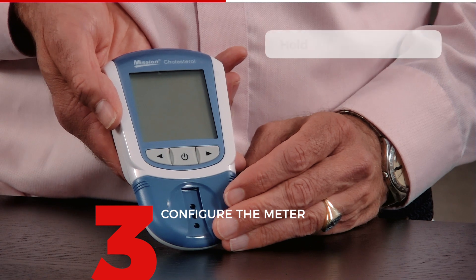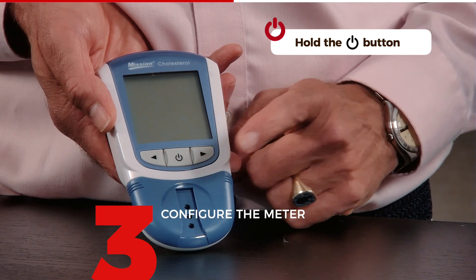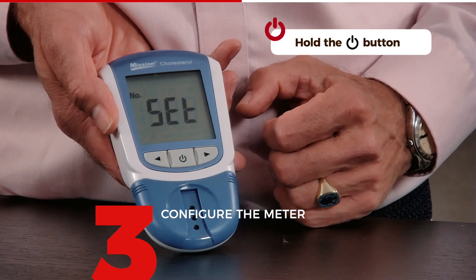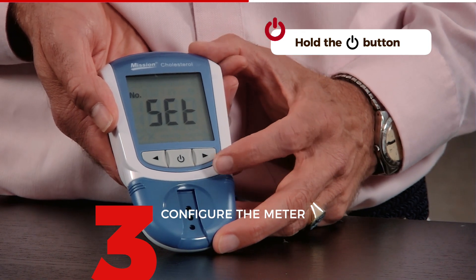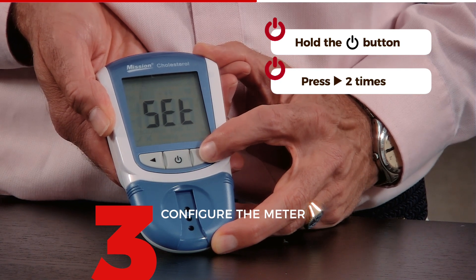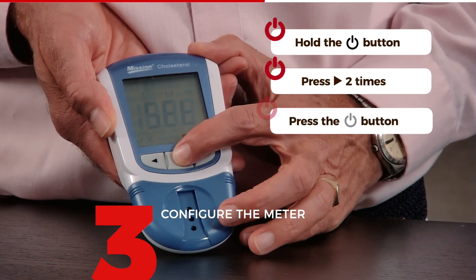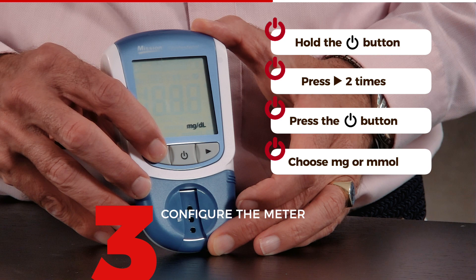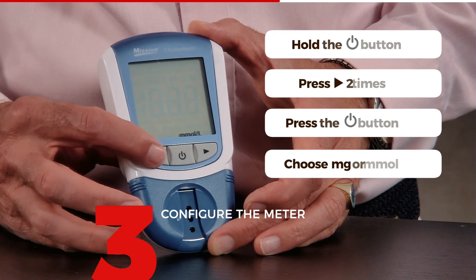Now we have to configure the meter. Press the center button for about three seconds until you hear a beep, and you will see it enters set mode. You then go two steps to the right to get into setup mode, so I just press twice, then press once to confirm. The first thing you get to do is choose milligram or millimole. In most countries millimole is used, so I'm going to use that and confirm.